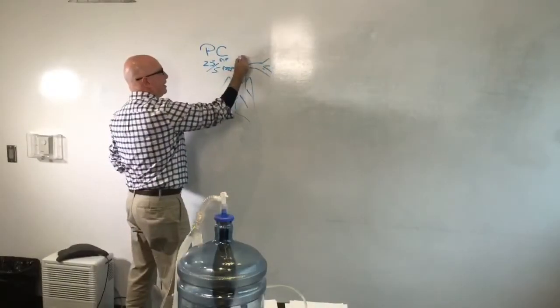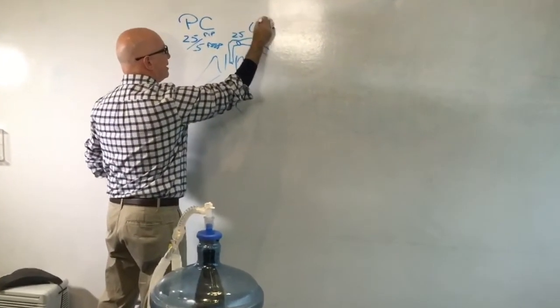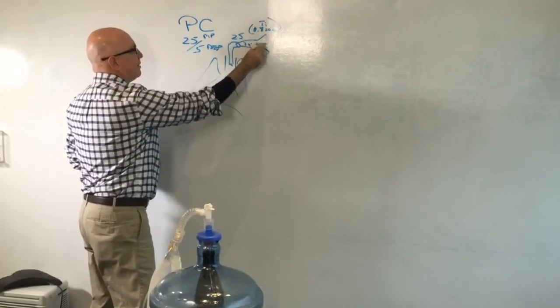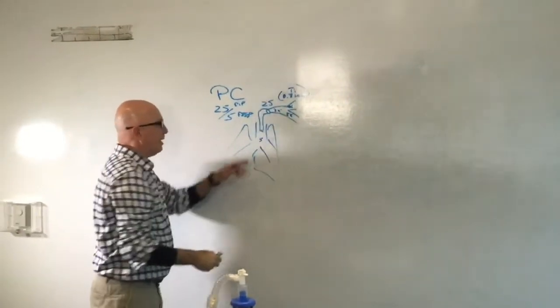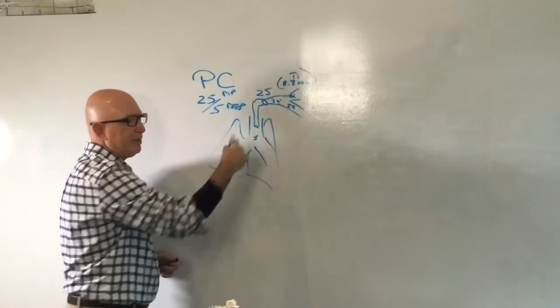When the ventilator cycles into inspiration, and let's say you've got it set for 0.8 second inspiratory time, the machine simply pressurizes its circuit to 25 centimeters of water. At the beginning of inspiration, your airway is at 5 centimeters of water. So the flow down the endotracheal tube is simply in response to a pressure gradient.